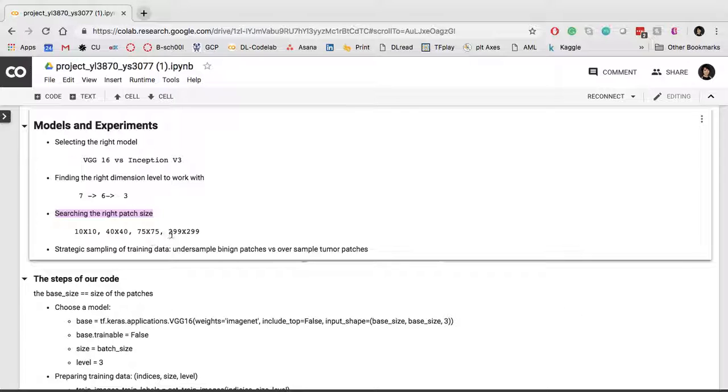Lastly, we noticed that the quality of the training data is vital for ensuring the model quality. When we fed the original image as is directly into the model, it learned a lot of non-cancerous patches because they are the majority. So our model tended to predict every patch as healthy. This would be terrible because it predicted a lot of false negatives, meaning that we failed to detect the cancer.